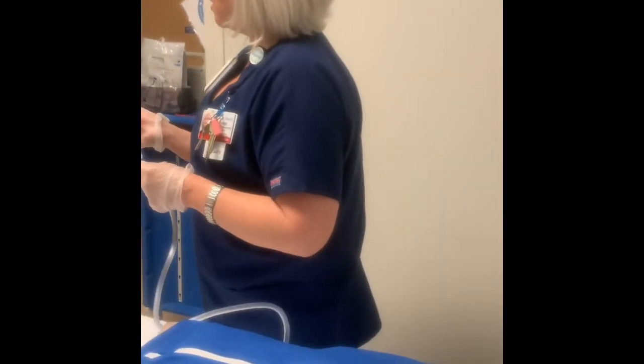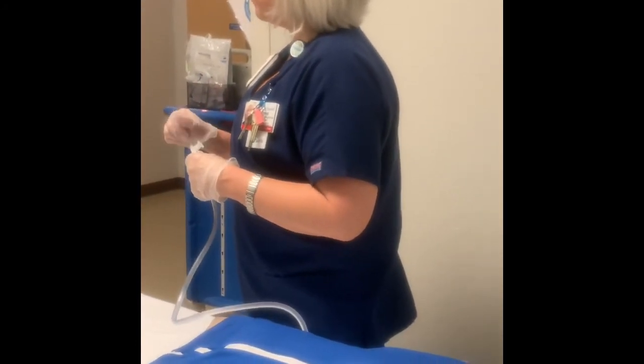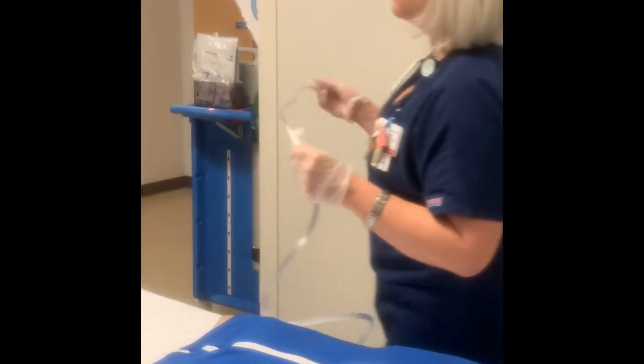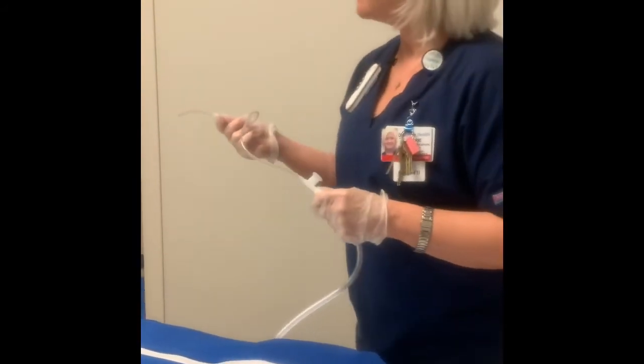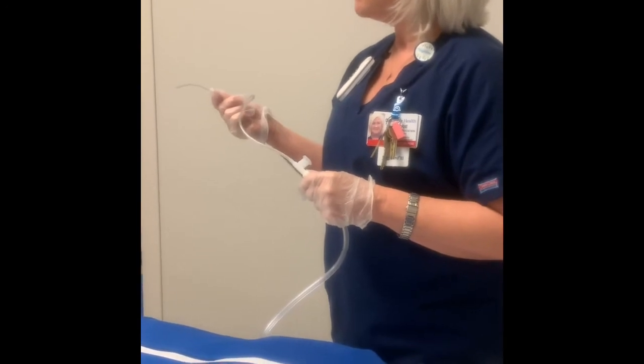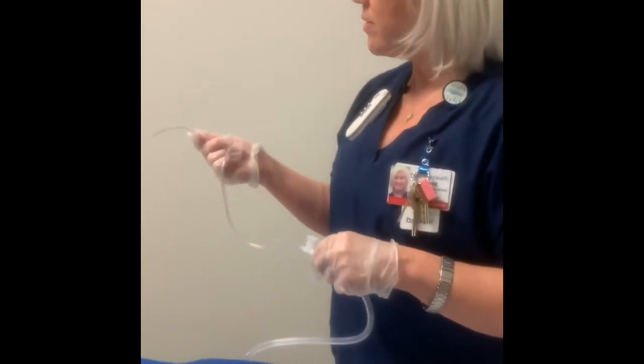Just so you know, here we don't do that. You guys aren't ambuing here whatsoever? You just suction them out. Or do you monitor their sats? These people are pretty well established trachs. They're caring for these at home and they're good. Sometimes it's the position when we get the mask and we lay them down that they get a secretion built up, and so we just come in and suction it. It usually only takes one or two times and they're good to go. But we don't ambu. You don't ambu before or after? No. Well, then that's whatever your policy is over here, then do that.